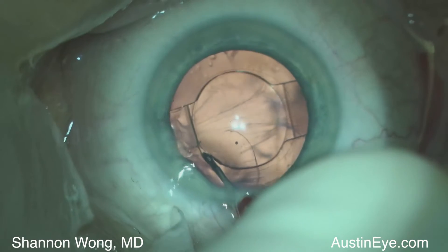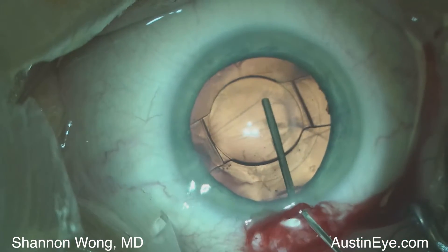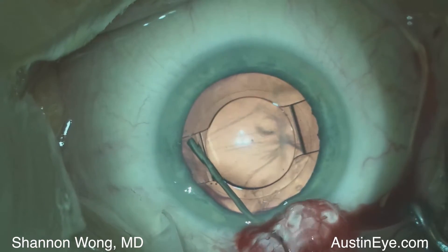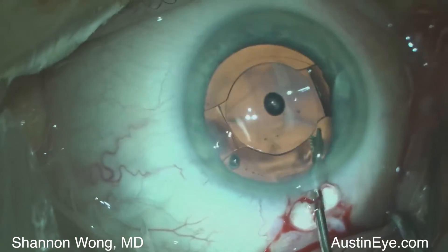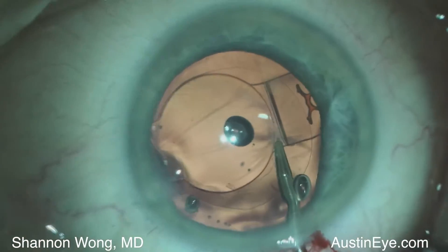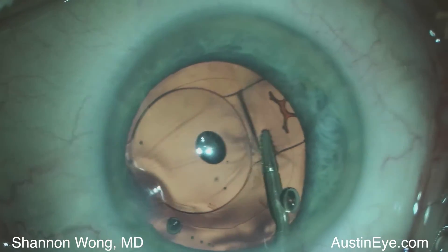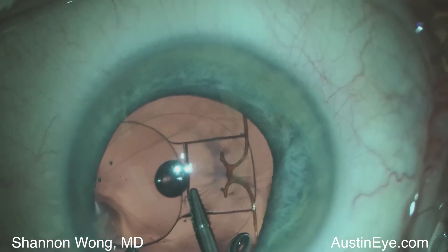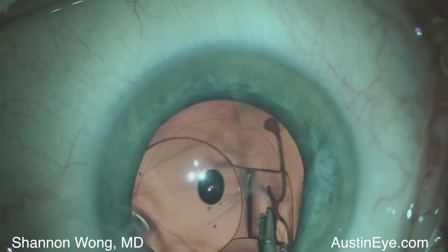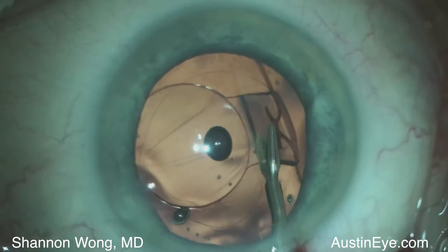We've filled the eye with lidocaine and Helon GV, and here we're placing Helon GV posterior to the lens to elevate it and to separate the capsular bag leaflets. We then use MST-IOL graspers and we're able to visualize the haptics of the Crystal lens on one side.